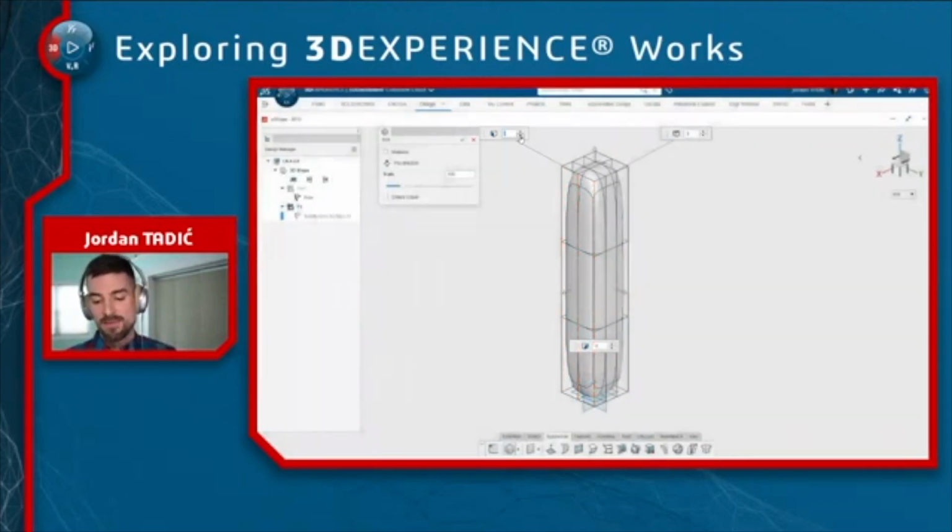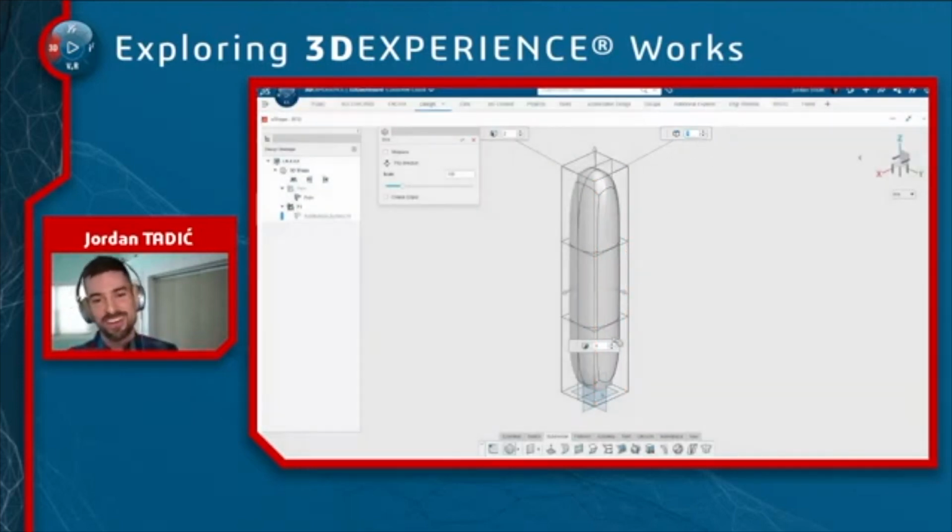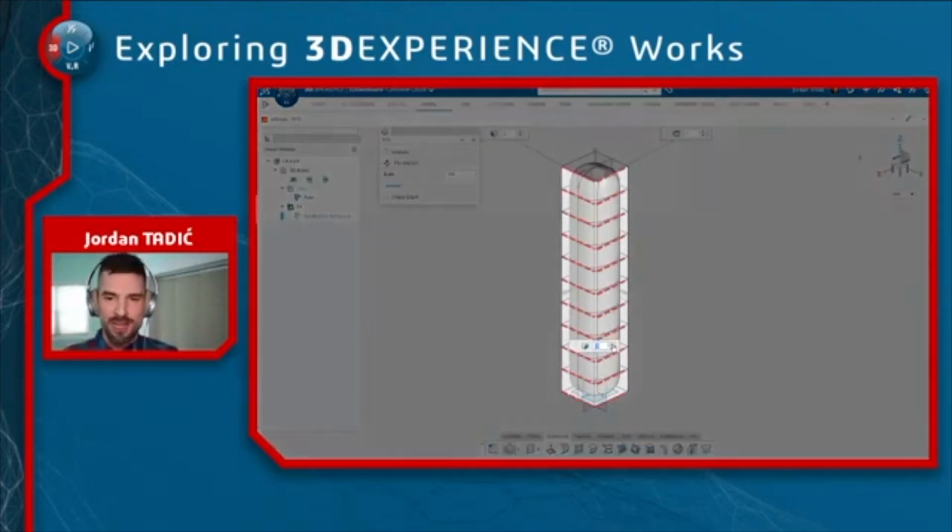Now for the side of the finger, I don't need it to be symmetric from front to back, because we're going to have the knuckle on one side, the little crease on the front. So I'm just going to choose 1 column of faces, which gives me a nice round radius on the side. And then for the length of the finger, I'm going to choose 10. And you don't have to get this right on the first try, because you could always insert loops after the fact, or you could delete loops if you've added too many.